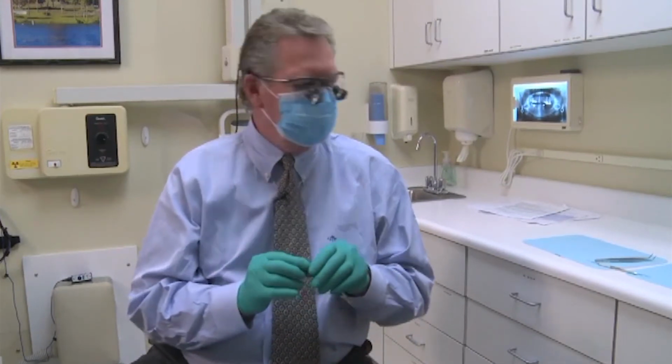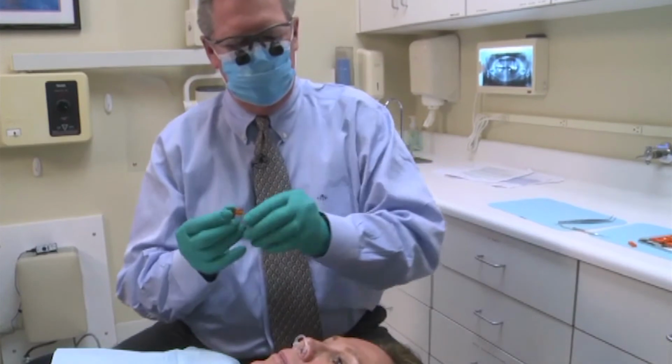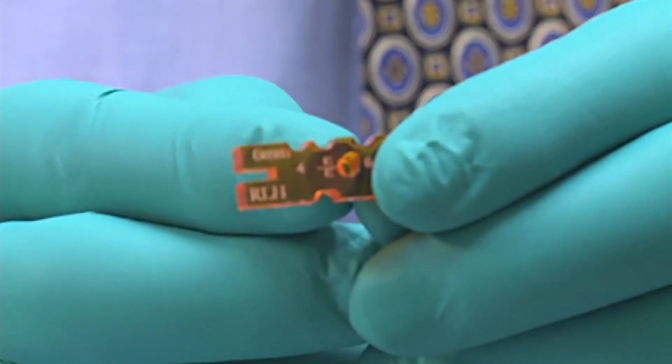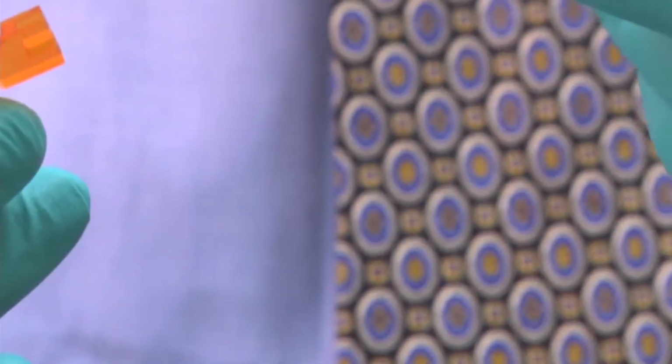So Tammy, let's go ahead and get prepared to do our bite registration. And what we're going to do is switch back to the 6 millimeter vertical. Notice it goes 4, edge to edge, and 6. So we're going to use the edge to edge. It doesn't matter what number faces the throat in this position, because edge to edge is edge to edge.